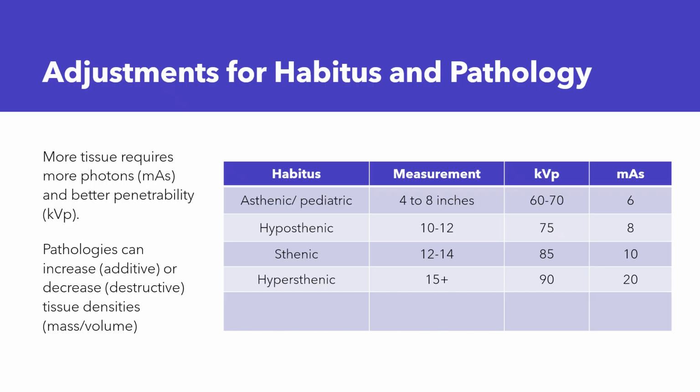Almost if you set a milk jug full of water on top of the abdomen and try to shoot through both of those. So ascites is adding a volume of water to the X-ray beam. Okay. Well, it's harder to get through than just the normal tissue itself. Those water molecules impede the progress of the X-ray beam, and you need more penetration and you need more photons.